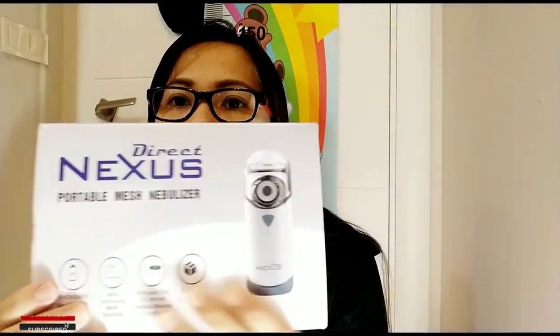Hello guys, welcome back to my YouTube channel. For today's video we're going to be unboxing what we purchased online — this is a Direct Nexus portable mesh nebulizer. This is the nebulizer for my baby.